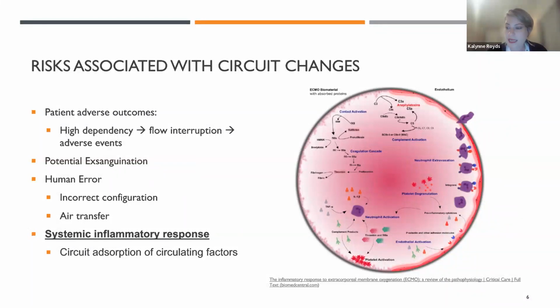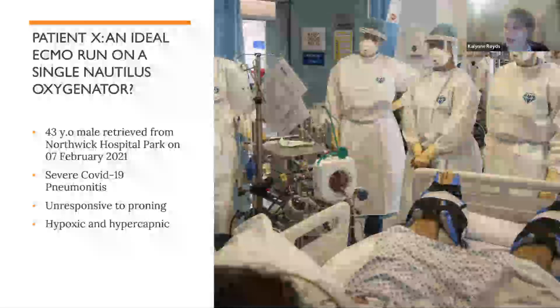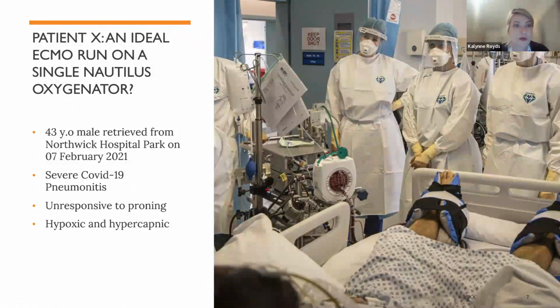And this is what ultimately causes end organ damage in our patients. So this then leads me to the heart of the presentation, which was a patient who had a singularly extraordinary run on ECMO. I'll refer to him as patient X from here on out.